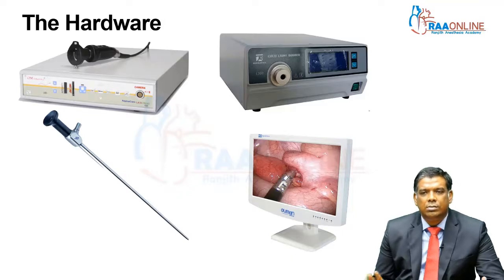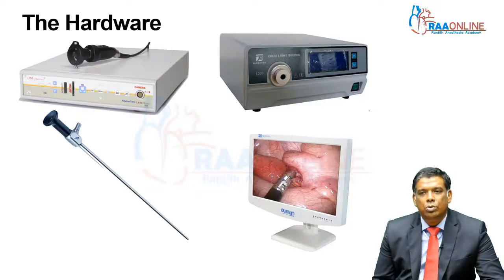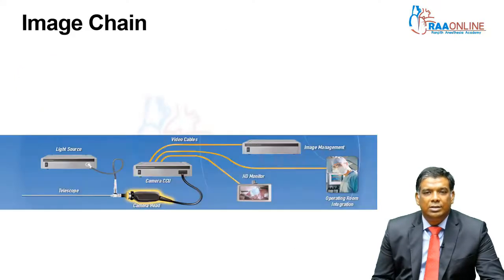Now there are many products available on the market, ranging from a full system available for just 2 to 3 lakhs to a top-end system, which could be a 4K camera and monitor system, which could cost you around 65 lakhs. So the hardware is an absolute essentiality, but depending on your budget and the type of surgeries that you are going to be doing, you naturally cater to that.